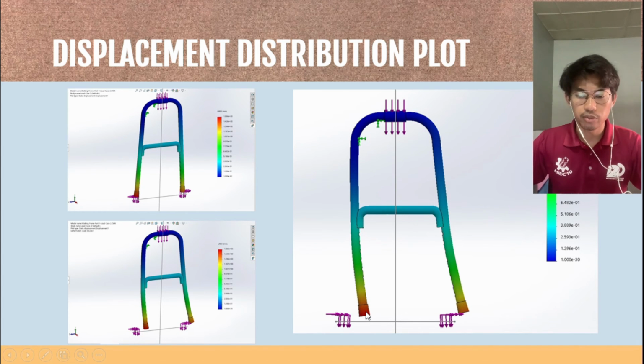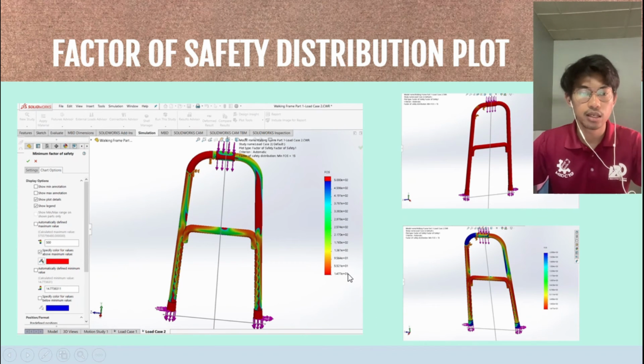So you can see from the analysis, the color is slowly changing from the brighter color at the tips of the legs to the top of the walker frame. So this is accurate as the greater stress occurs at the tips of the legs of the walker frame. And this is the factor of safety distribution plot for the walker frame. From the finite element method analysis software, we found that when we use the high quality mesh type, the factor of safety is 14.77, while when we use the draft quality mesh type, the factor of safety is 18.